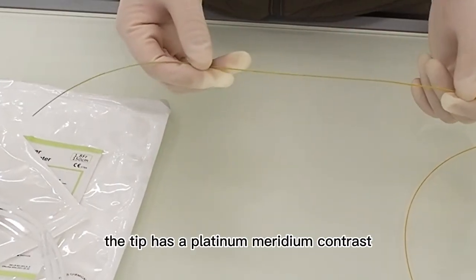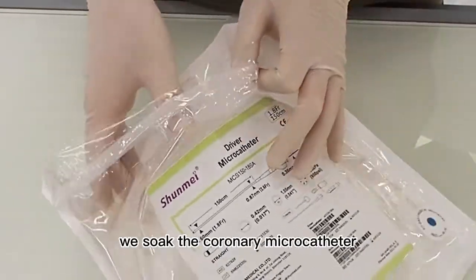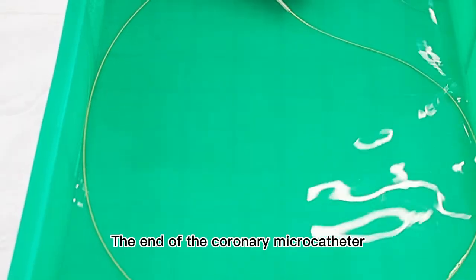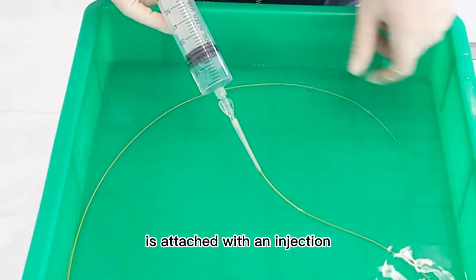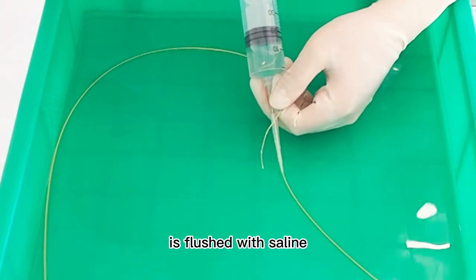The tip has a platinum-iridium contrast ring for good visibility. After unpacking, we soak the coronary microcatheter in saline for 1–2 minutes. The end of the coronary microcatheter is attached with an injection and the lumen of the coronary microcatheter is flushed with saline.